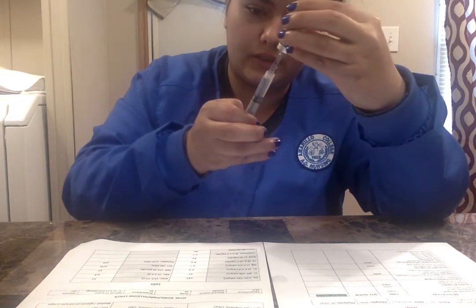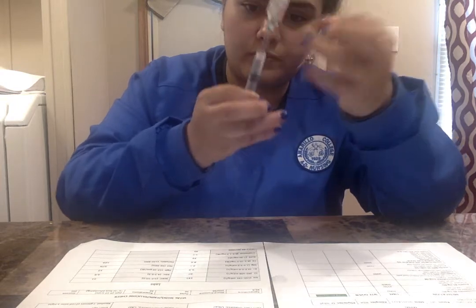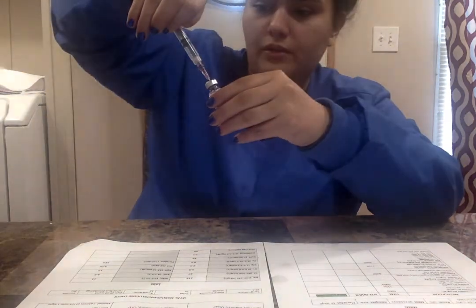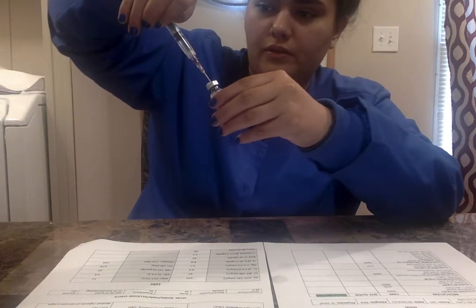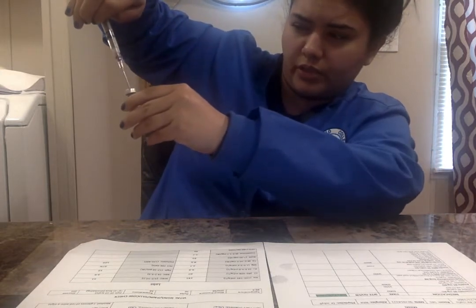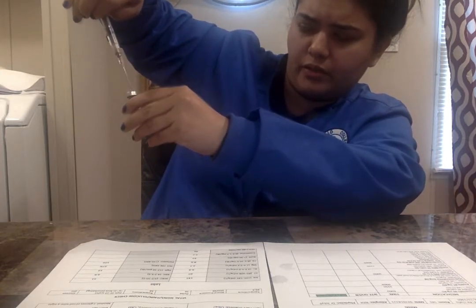Okay. So next, I'm going to make sure there's no air bubbles, and there's not any. I'm going to take it out of the glass vial. It usually squirts me, so I don't want it to squirt me. Okay, it didn't squirt me.